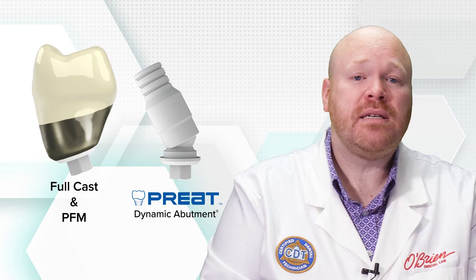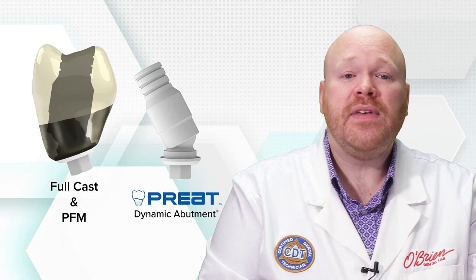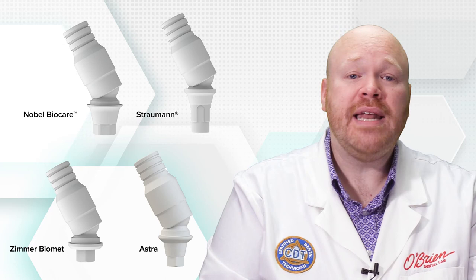The dynamic abutment sold by Preet is a plastic castable UCLA style abutment which allows the lab to create traditional screw-retained full cast and porcelain-to-metal crowns. The top portion of the dynamic abutment is rotated to the desired angle position and then wax is applied directly to the abutment for casting. These abutments are available for several systems including Nobel BioCare, Straumann, Zimmer, and Astra.